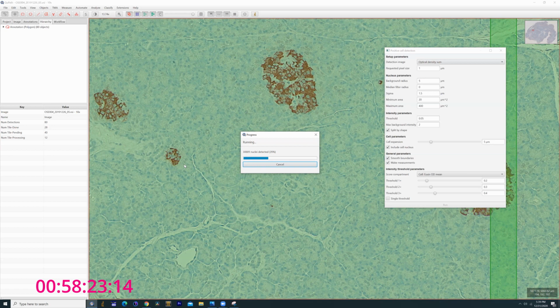So if you had, say, a nuclei to cytoplasm ratio, and you wanted to see how it distributes within a section, you can let it pick out the colors or grade, and it has a lot of nice display functions built into it. But that's beyond the scope of what I'm going to cover tonight. I think this is it, and then I'm going to show you the numbers, and then we will close down. And anyway, it's a good starting point.